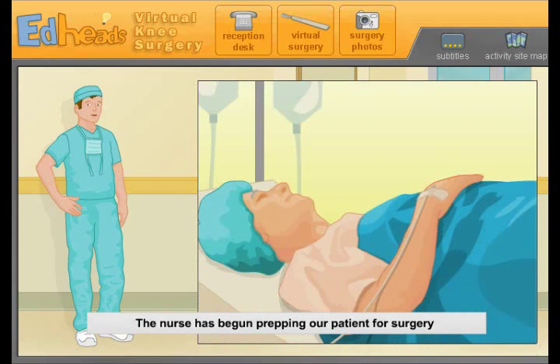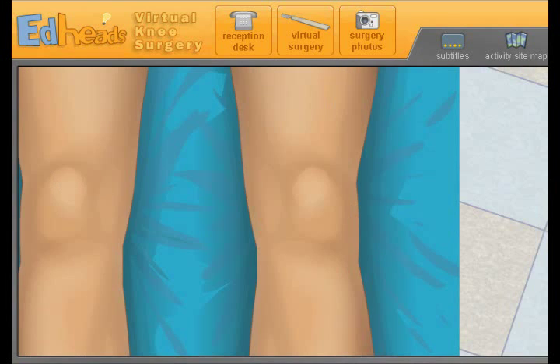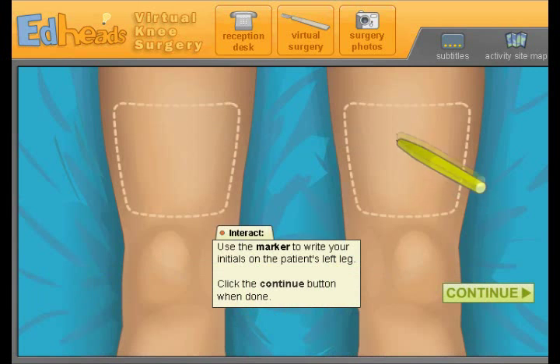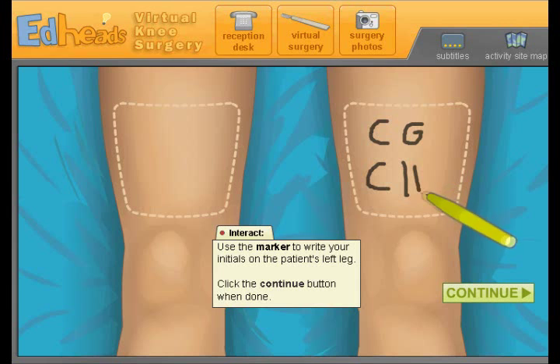The nurse has begun prepping our patient for surgery by placing an IV needle in his right hand. Now it's your turn — use the marker and write your initials on the proper knee to be operated on. This may seem silly, but it's an actual step taken to prevent wrong-site surgeries. That's a smart idea — marking which one needs the work. So let's do C, G, and then C, H, so they know it's both of us.